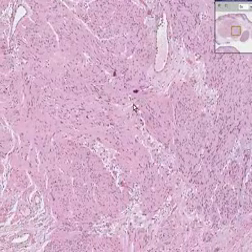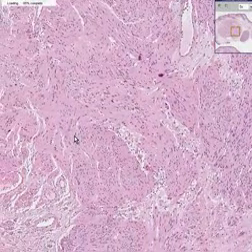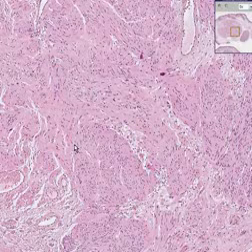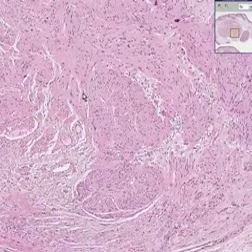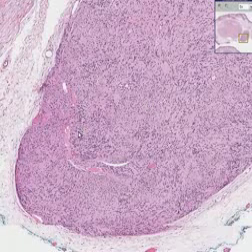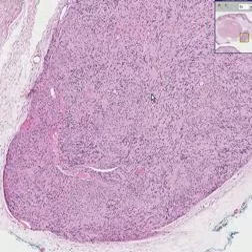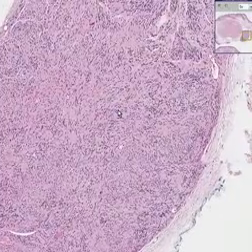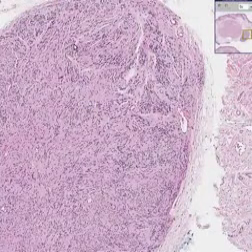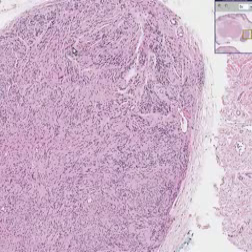How about if we say, maybe we could start to imagine a little bit of palisading along here. Do we have to go to another area? Oh, maybe we could see some palisading along here. And I really don't see, maybe some palisading along here.